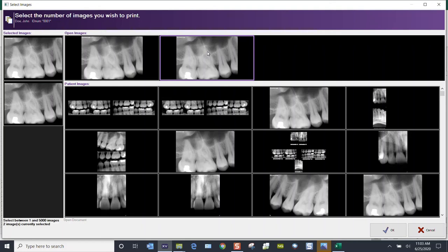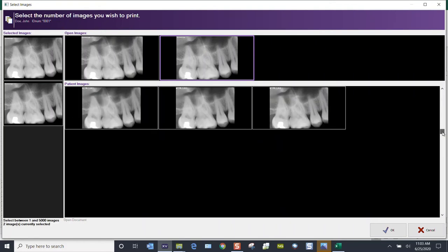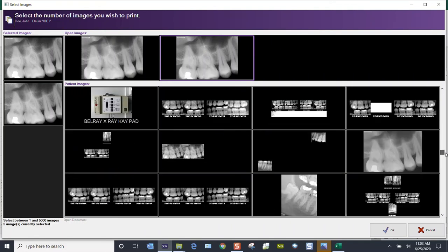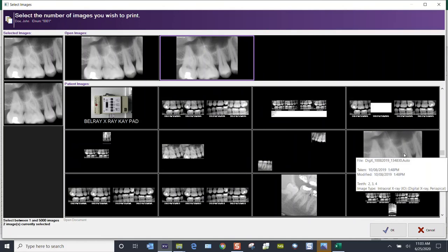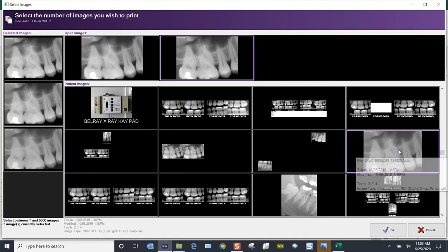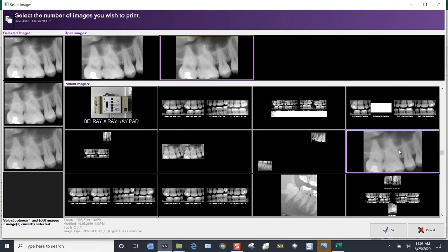Maybe there's another image of this tooth from a previous time. I can scroll back in time — you can see images from October 2019. I could select that image as well.